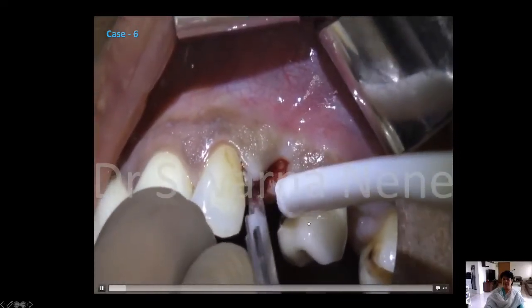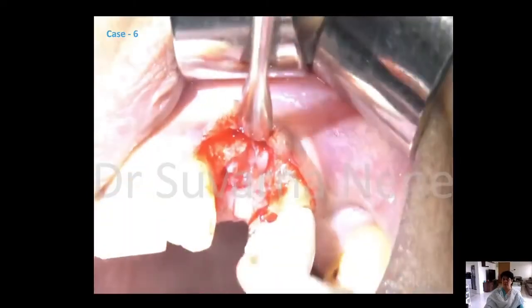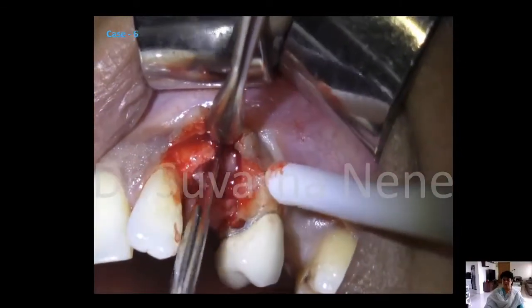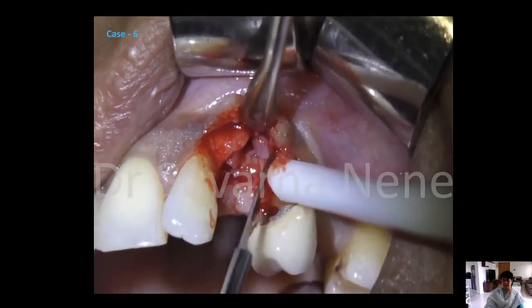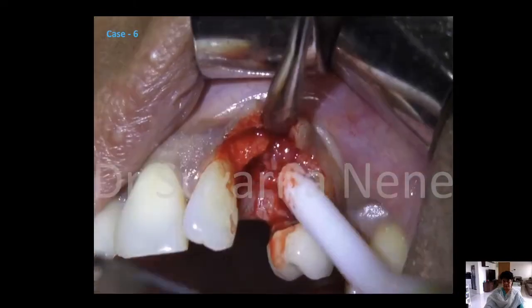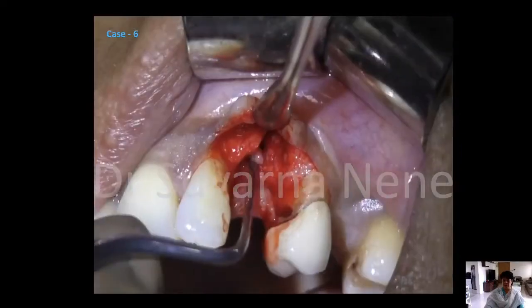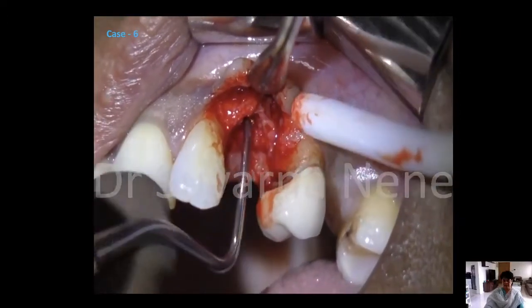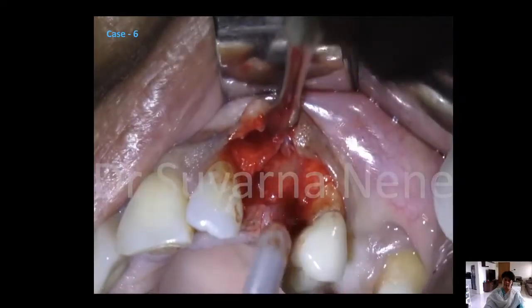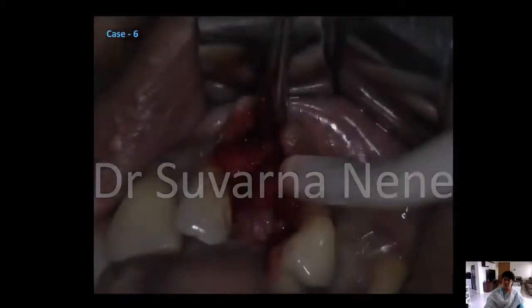The soft tissue is still closing in the socket region. Here I am going to go distally, because anyway I have to open the implant in 5, and I'm sure there's going to be bone grown over it. So this is the soft tissue which has entered the dehiscence of the cortical plate. Initially to separate the tissue, because curette not always is enough. And then once it is separated, you can curette it out without applying much force, because your buccal bone plate is not very strong. So you have to be careful by curetting.